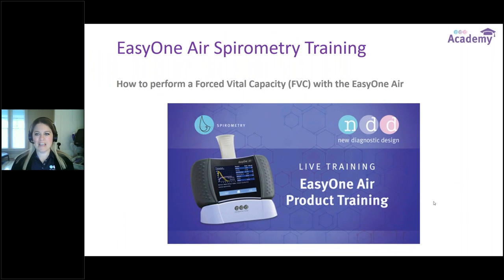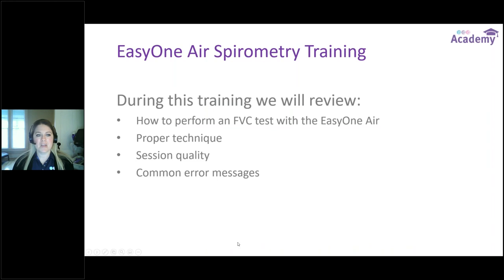Good morning everyone. Welcome to another NDD live training. We are covering the EZ1 Air spirometer again this month, and we're going to be going over how to perform the forced vital capacity maneuver, or FVC, with the EZ1 Air device. During this training, we will review how to correctly perform the FVC test, go over proper spirometry technique, review session quality grades, and then wind up with some common error messages.